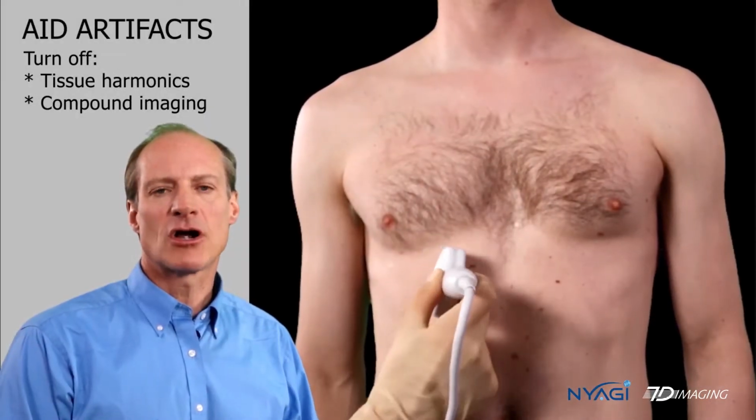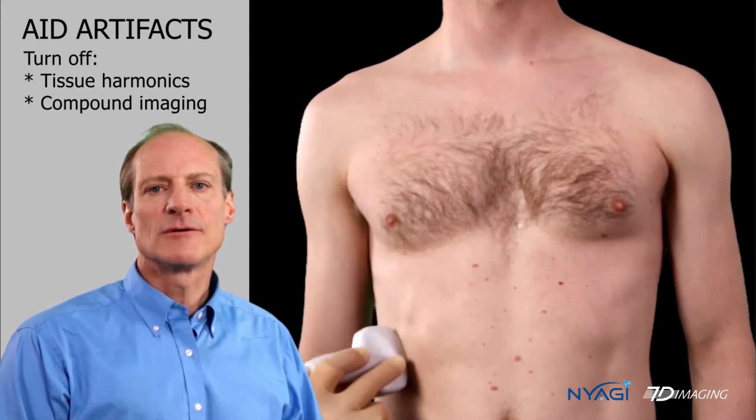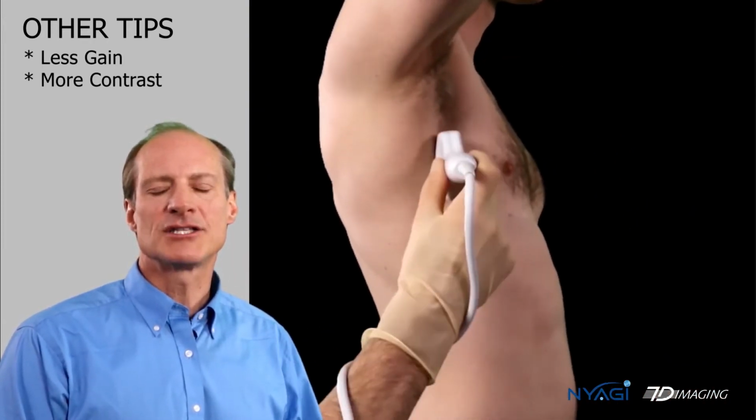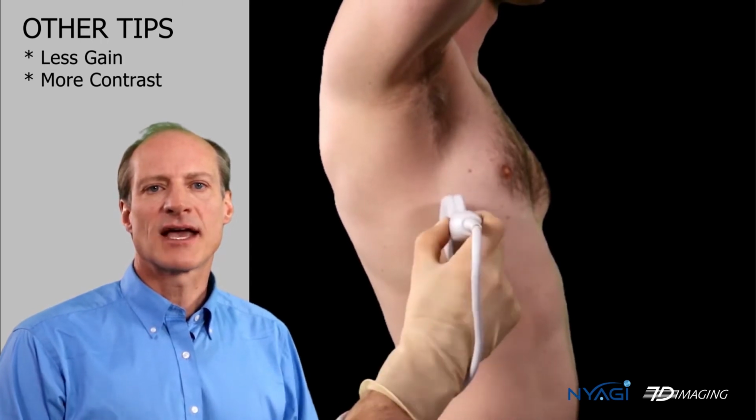Turn off tissue harmonics and compound imaging to enhance the artifacts. Sometimes the machines have features that minimize the artifacts, but in lung ultrasound, you want to maximize the artifacts for interpretation.